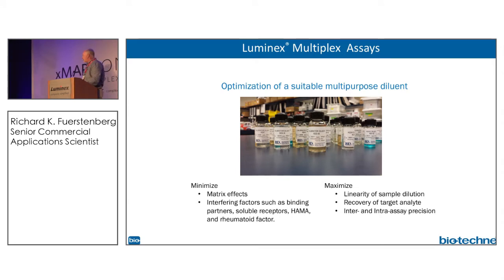Besides managing those interferences, we also have to ensure that the assay gives accurate results in terms of recovery, linearity, intra-assay and inter-assay precision. We want to be able to provide a good assay for you, obviously.